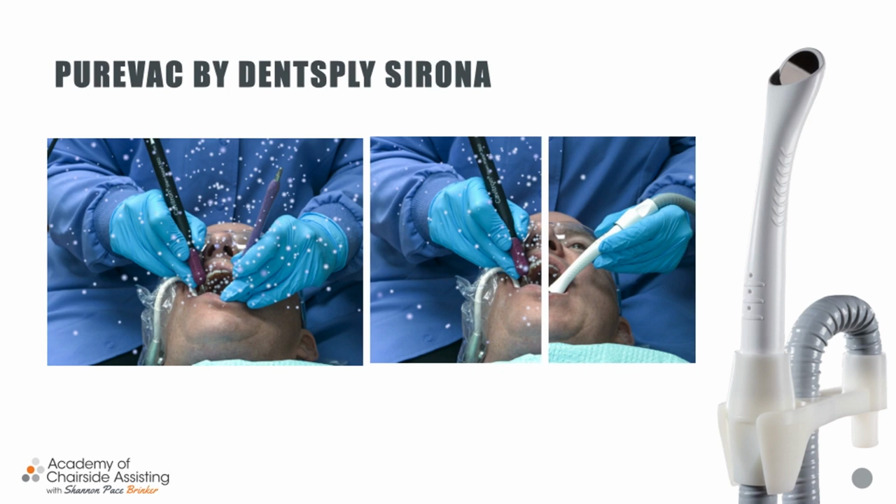it's cut by machine and it can cut the mucosa. It can cut the tissue. We can sometimes cause little canker sores with it, especially if you're a new assistant out there, and we know that, right? We're sucking up the tongue. Now listen, this is forceful, okay?